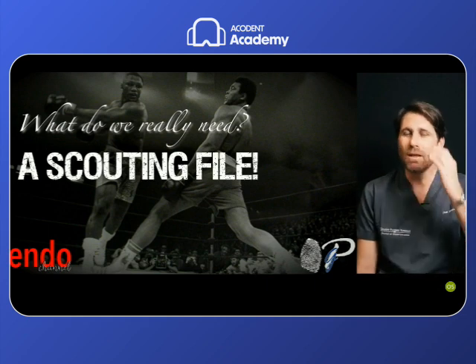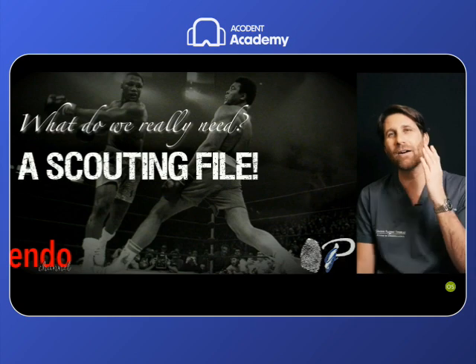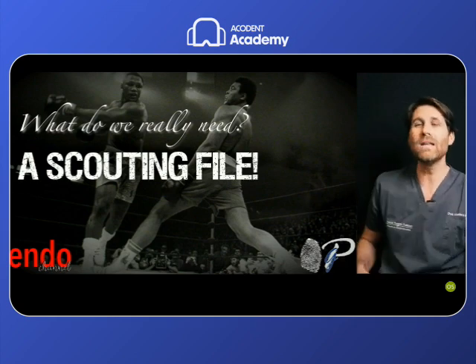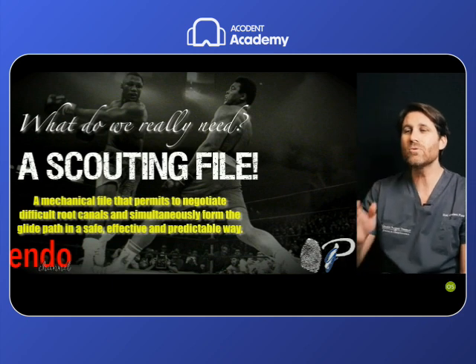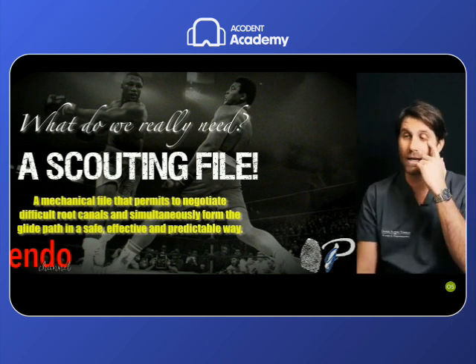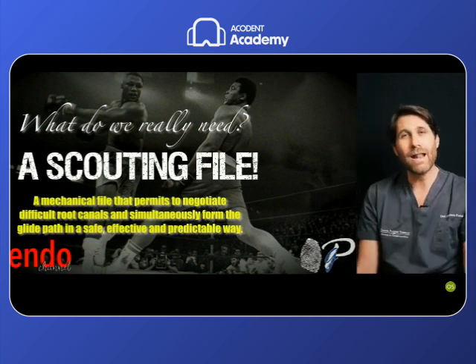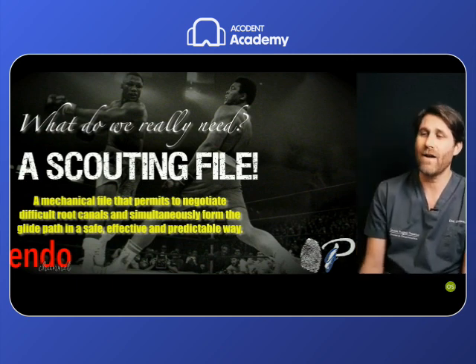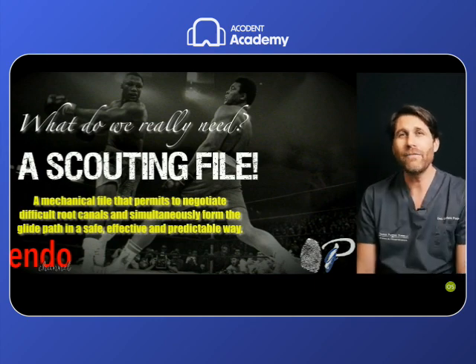In the previous examples that I gave at the beginning of these lessons, we needed a real glide path file. Today we need a real scouting file, a mechanical file that permits us to negotiate difficult root canals and simultaneously form the glide path and the preflaring in a safe, effective, and predictable way. So this is a different procedure from what we have seen before.